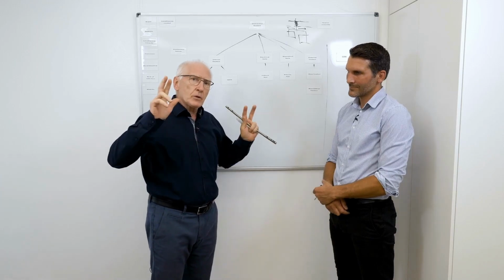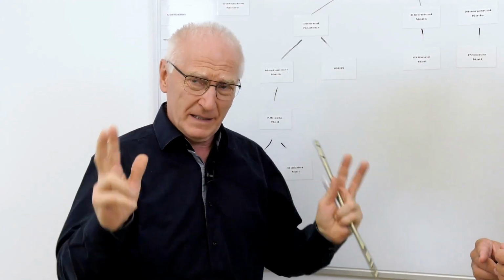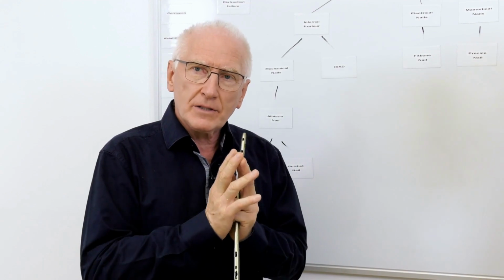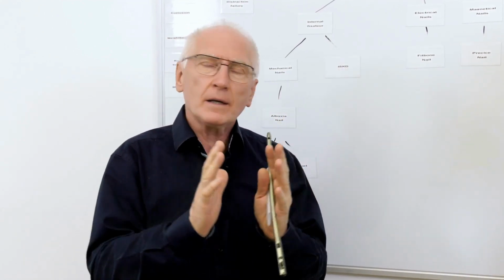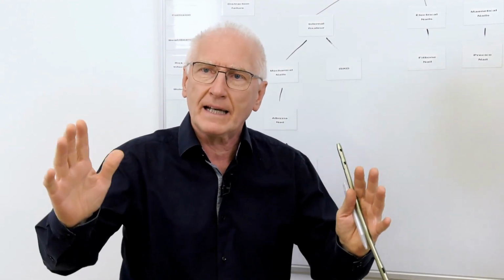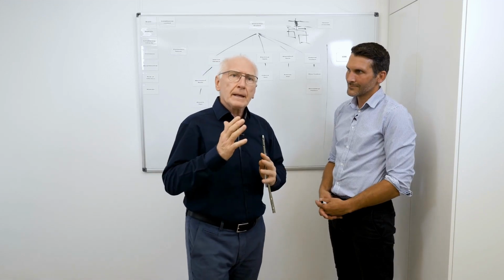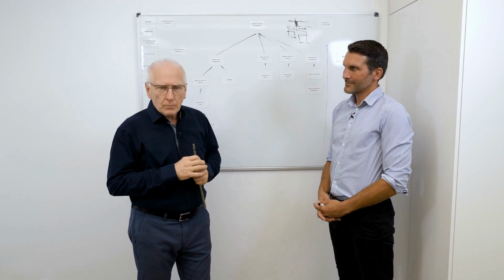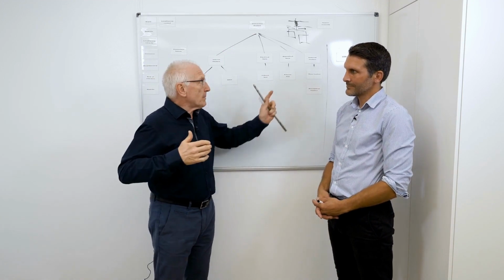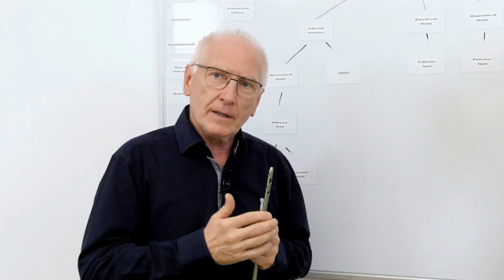We have to address two fields. We have to ensure stability, ideally so that the patient can fully bear weight immediately after the operation. He can't jump with it, he can't run with it, but he can walk accurately and carefully. He is allowed to do that, even for kilometers. But at the same time, we need to have strength in these internal systems for moving apart.